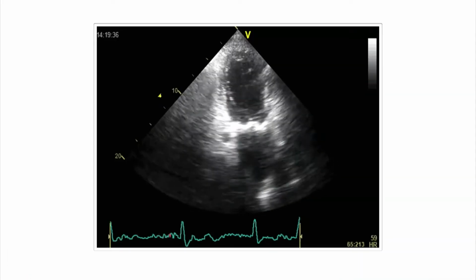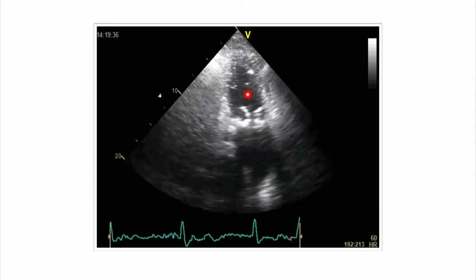We know that the patient had an inferior infarct. So this is clearly a case of a right ventricular infarct, which is in combination with the RCA occlusion. So important information, poor right ventricular function in the setting of myocardial infarction, as we already learned in the previous chapters, is something that causes a poor prognosis of the patient.